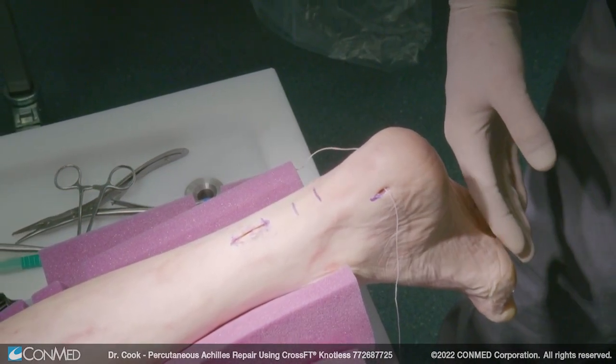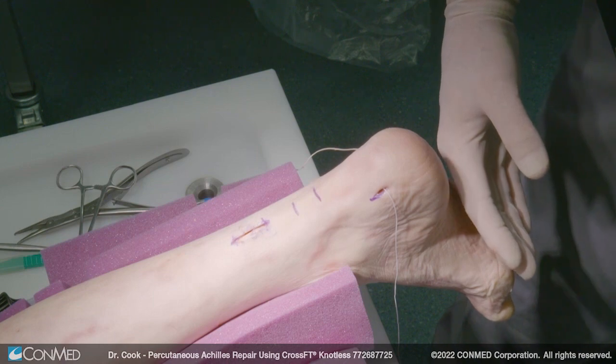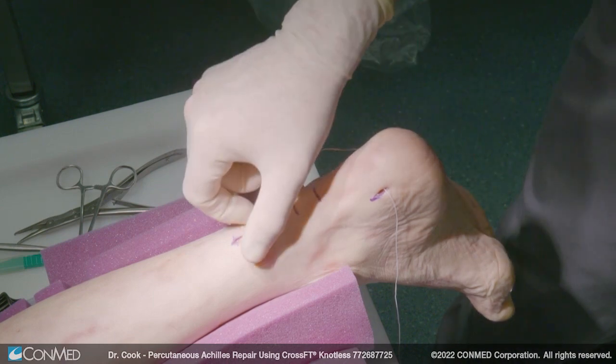So now we just close up these wounds. I have to cut the sutures off, but you now have the repaired Achilles.